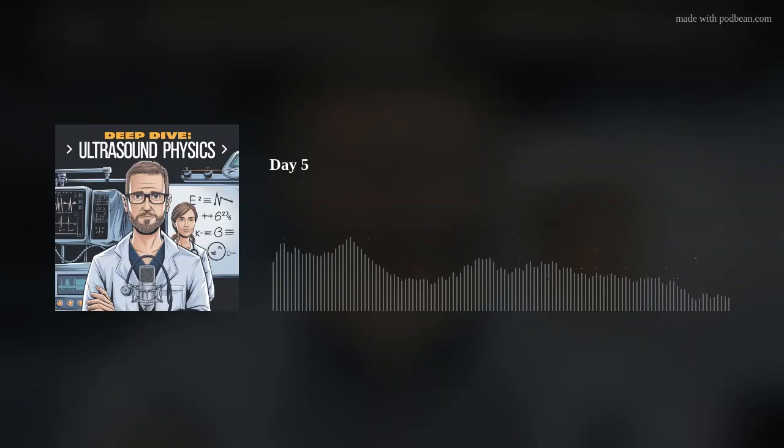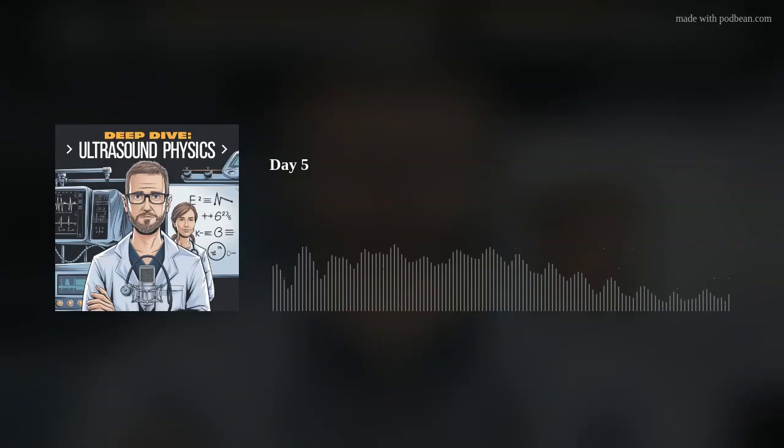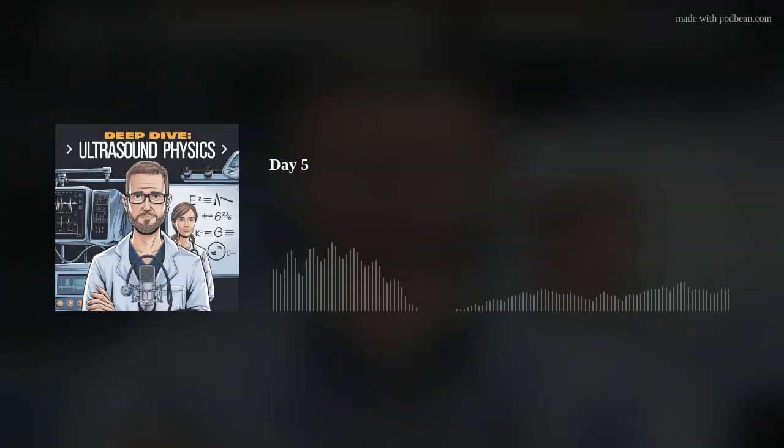Got it. So the PRF is our sampling rate, how often we listen. Precisely. And if the real Doppler shift is higher than half that sampling rate, the system just can't keep up. It gets confused, and you get aliasing. So if you don't sample fast enough, you miss crucial info, and the picture gets distorted. That's a big deal clinically. Huge deal. You need to recognize it.